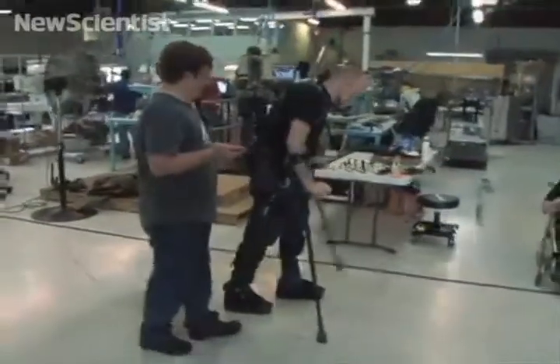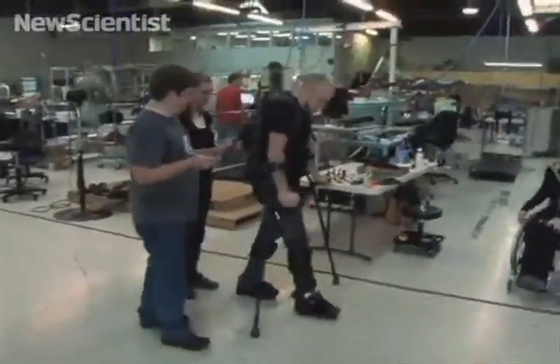Our focus right now with the product E-Legs is to take that device into rehab facilities around the country and allow people to retrain their gait and to allow them to get up and exercise their bodies in ways that they have not been able to do with traditional rehab facility equipment.